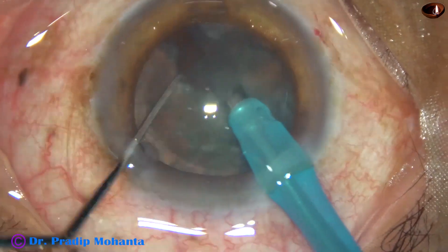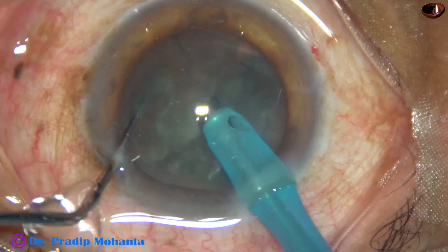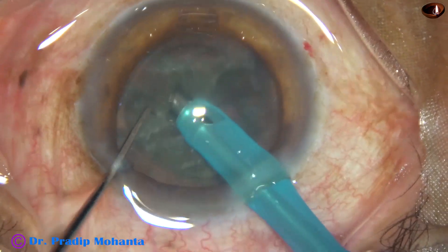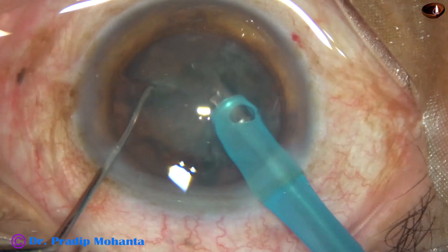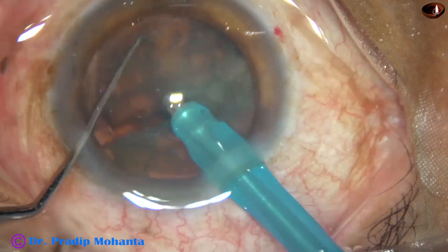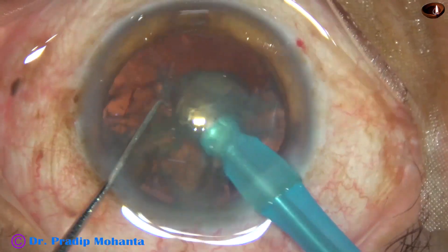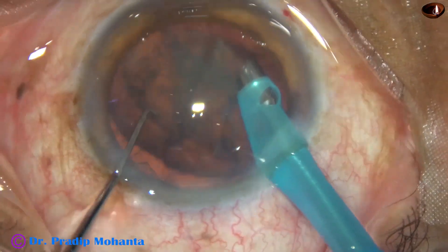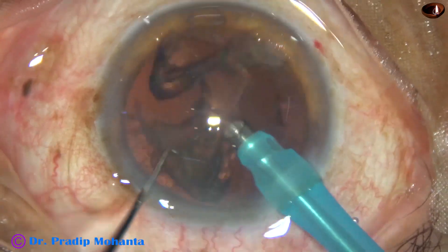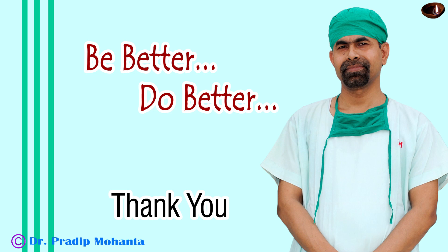This is very much possible and not a difficult procedure. Just you have to make a pit, support the lens mass in front, and bring the chopper from the equator towards the tip of the FACO needle. Once the nucleus is divided into several fragments, emulsifying these pieces is very easy. We don't need much ultrasonic energy — about 20 to 30% is just sufficient to remove these lens fragments. Hope this will help you in managing your soft cataracts.